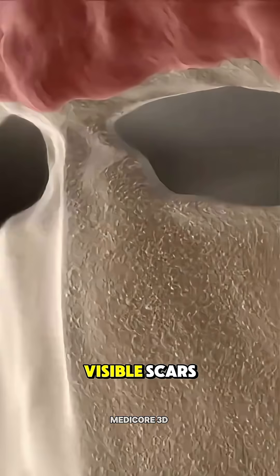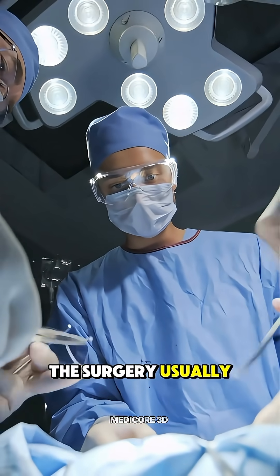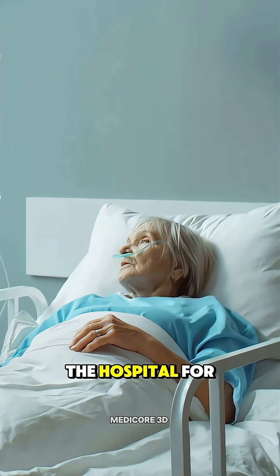There are no visible scars, since it's all done through the nose. The surgery usually takes a few hours, and most patients spend a couple of days in the hospital for monitoring.